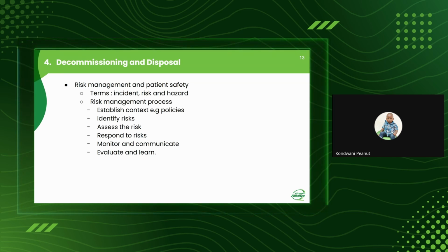You should continuously monitor with the users and even the surroundings, the guardians and so on. And finally, you need to evaluate and learn from the lessons. Risk management is a live document. It's a live process, whereby you don't just do it for a day. You continuously do it, update it and learn from it.